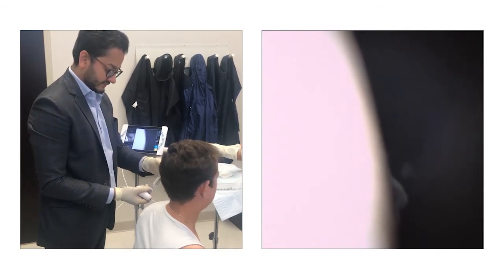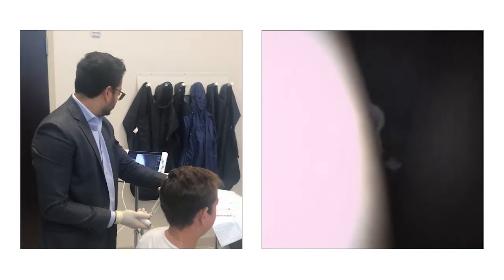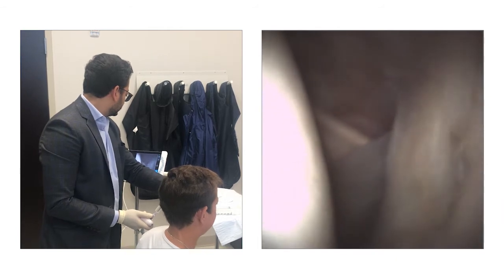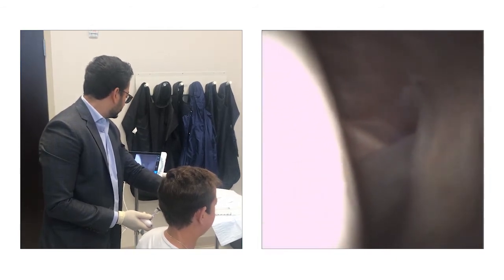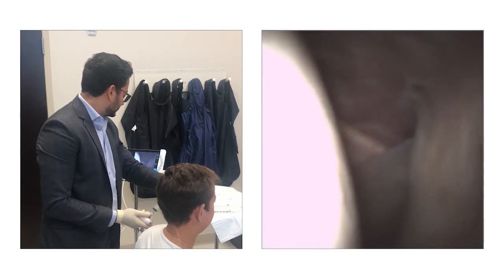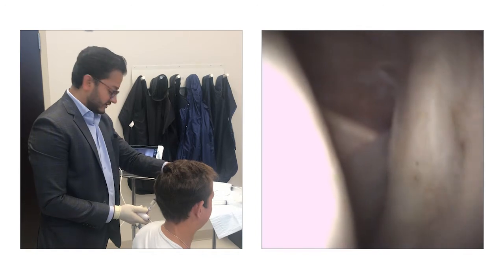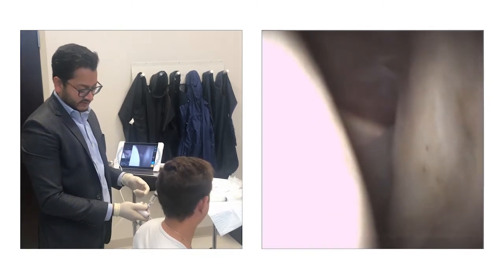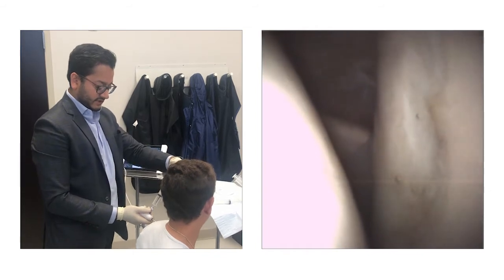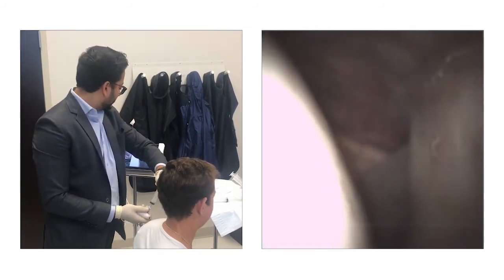You can see it moving and extending. Just give me the last little bit of fluid. You can see the pressure of the fluid coming back. I'm going to pump that through again, just sort of pushing and living in. Stretch out.